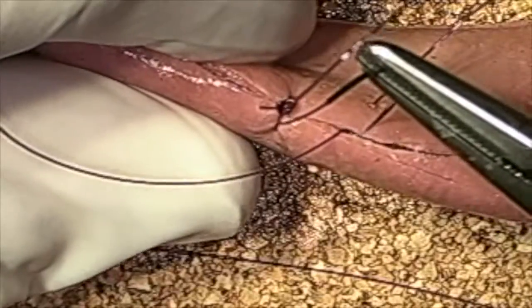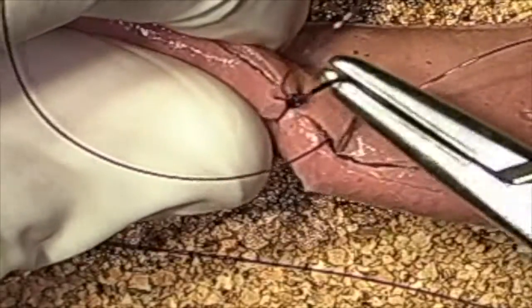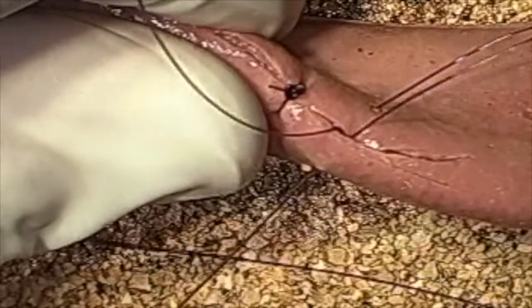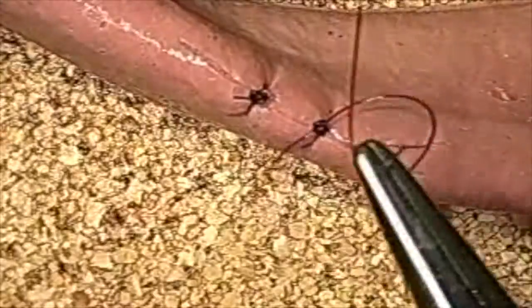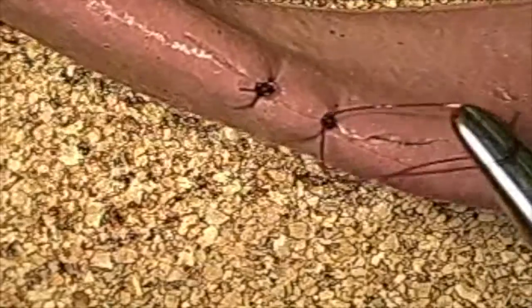This is just going to be a modified Gamby, which means I'm not going full thickness. I'm actually going just below the submucosa. Once I have that bite, I'm going to do a very similar type of pattern. I'm going to go ahead and do my surgeon's knot and then follow it with about four to six other throws on top of that, depending upon how secure I feel. Again, this is a monofilament absorbable suture, PDS. In small cats and dogs, it's going to be about 4-0, and in larger dogs, you can go with potentially 3-0.